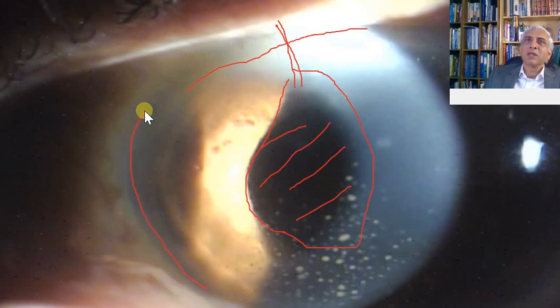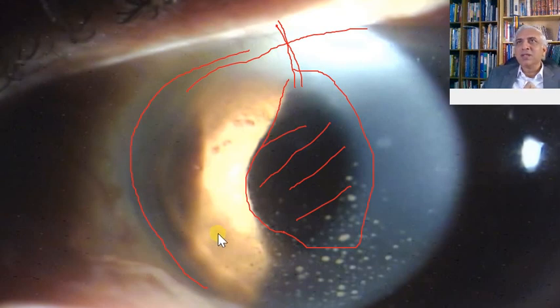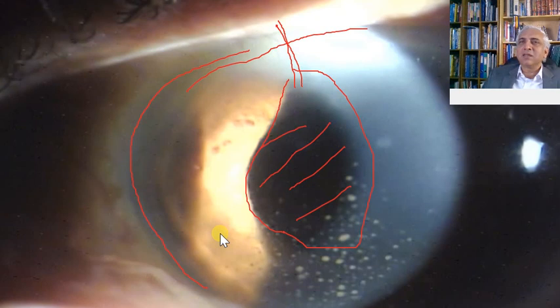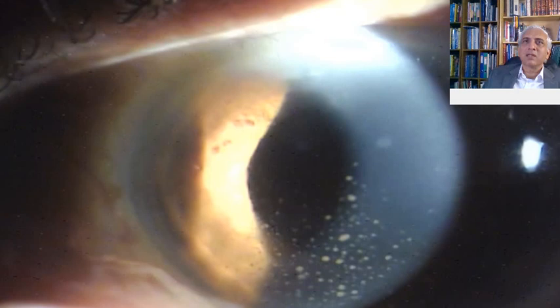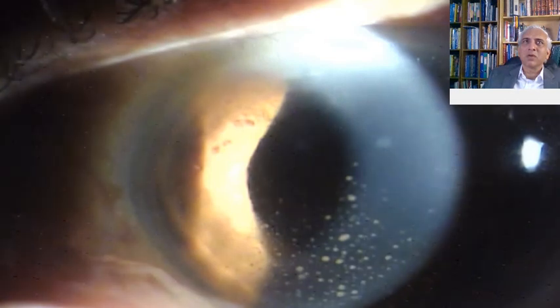Another important thing is to assess whether this is very active disease. The ciliary congestion is not very marked here, so it looks like a low-grade inflammation is happening. Let's start the video from the beginning and see what we have.